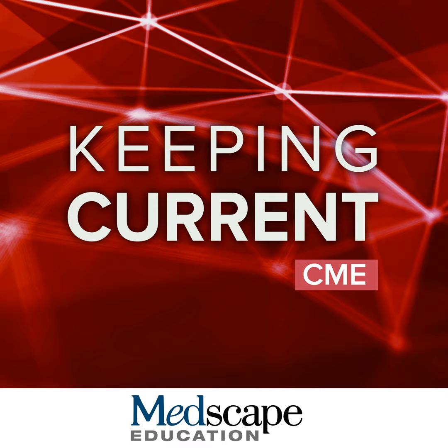So here's a case. We see in this study, on your left-hand side, we have a hepatobiliary defect that is mildly T2 bright. When I think about lesions on T2, we think of benign bright, things like cysts or hemangiomas, and then the scary bright or malignant bright. That's mildly bright. This is that case, where there's this mildly bright lesion, and it has diffusion restriction. This would be a positive hepatobiliary phase AMRI.